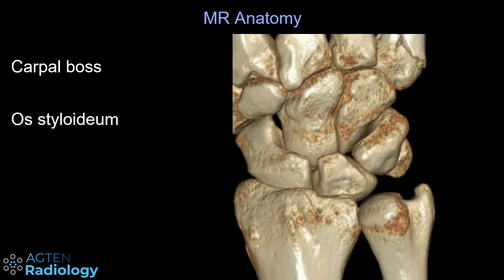On the dorsal aspect of the wrist you can either have a carpal boss or an os styloideum, and the difference is the base, here shown with the mouse. If it's fused with the metacarpal base then you would call it a carpal boss, and if it's a separate ossicle then it's an os styloideum.